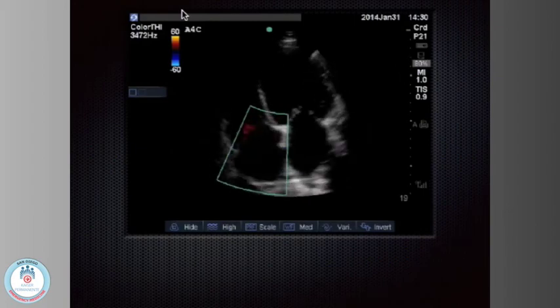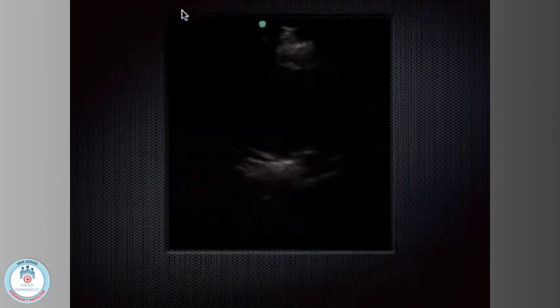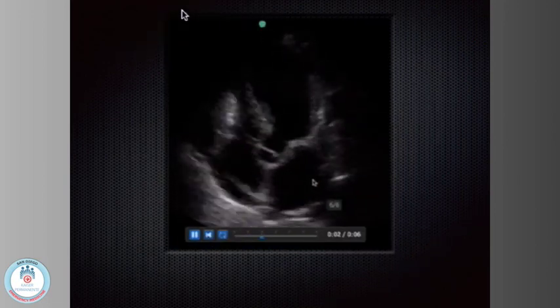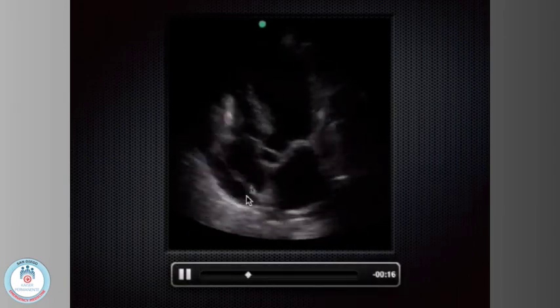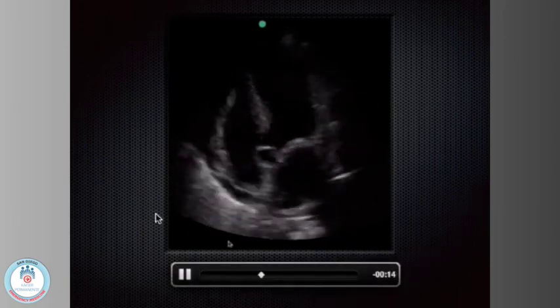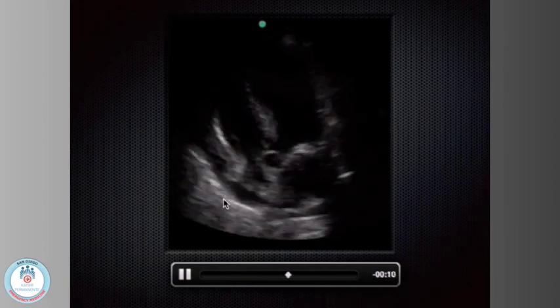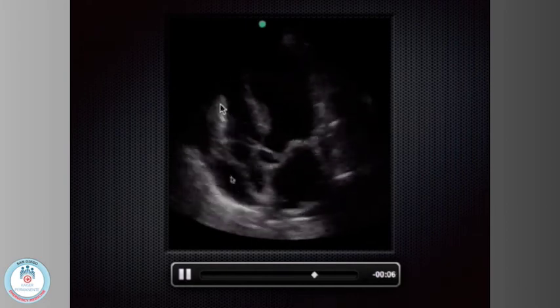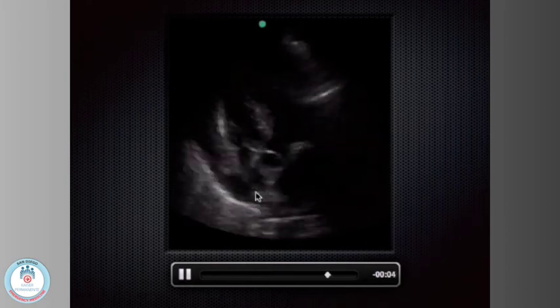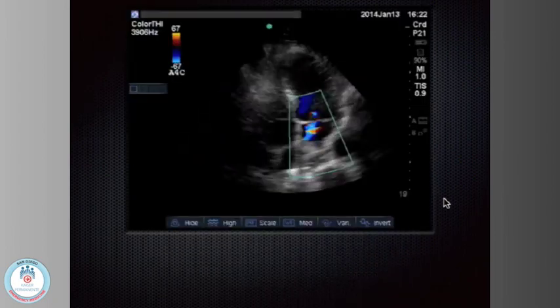Diagnosis. Tricuspid regurg, very good, yep, very good. And just another example here of a nice pericardial effusion. See, we're doing the apical four-chamber view, but it's almost like somebody has a punching bag and they're punching that right atrium right up in there like that. I like to think of it that way. But it's also this kind of dancing free wall of the RV. You can see my fellow calls this the magic carpet ride. But that's the idea.